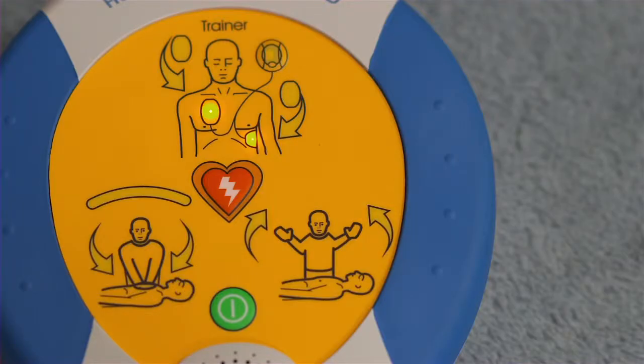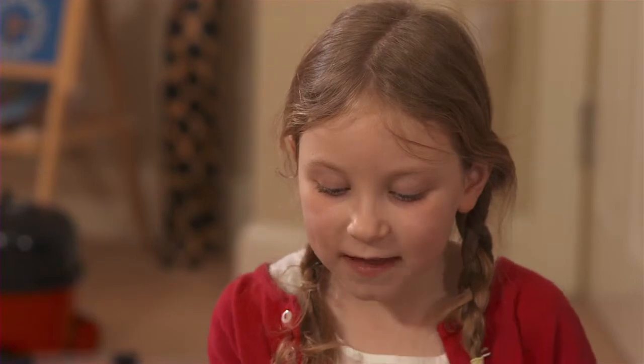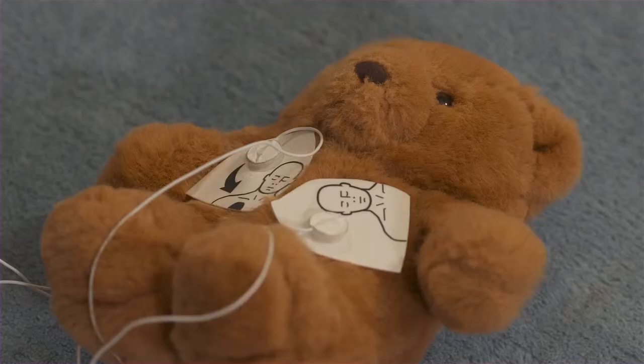Assessing heart rhythm. Do not touch the patient. Stand clear of patient. Shock advised. Press the orange shock button now to save Teddy. Shock delivered. It is safe to touch the patient.